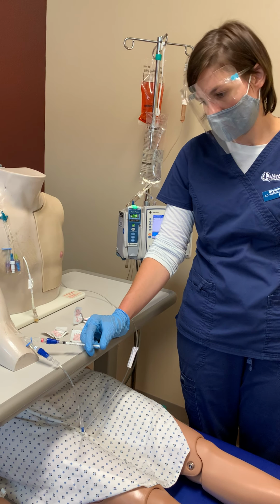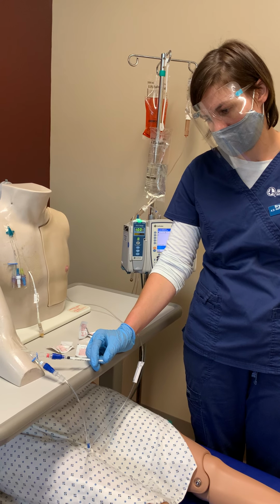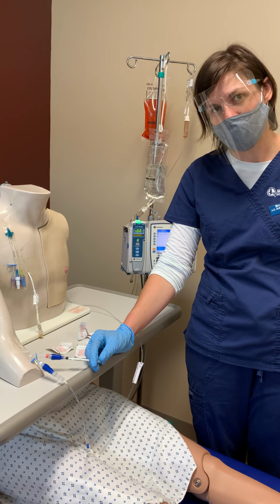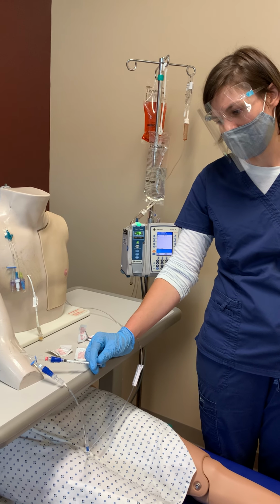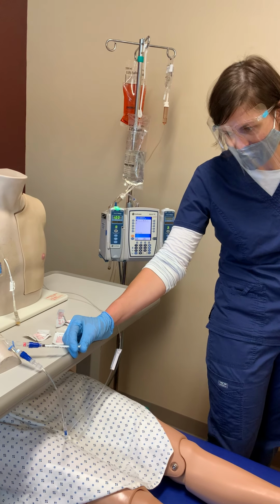Okay, and we're going to say, for sake of time, that this is 3 minutes, 2 minutes, 1 minute, and now it's been 5 minutes. So I've administered my morphine over a total of 5 minutes.